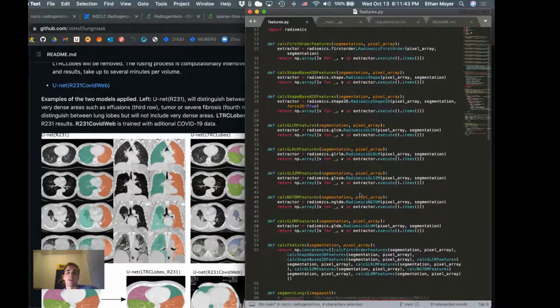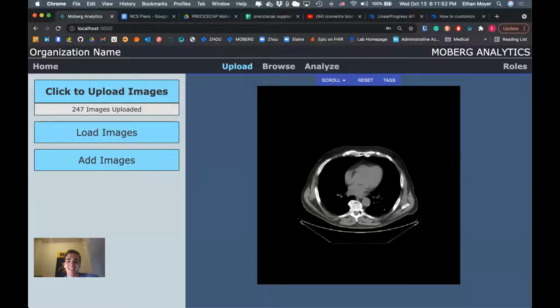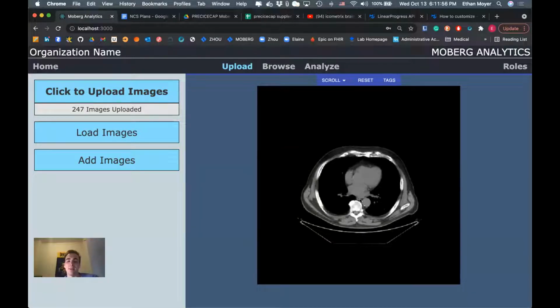What I was talking about was selecting the best CT image from each person, because we're going to want a set of features that best represent the cancer of each person. And we're using these features to predict the reoccurrence of the cancer.